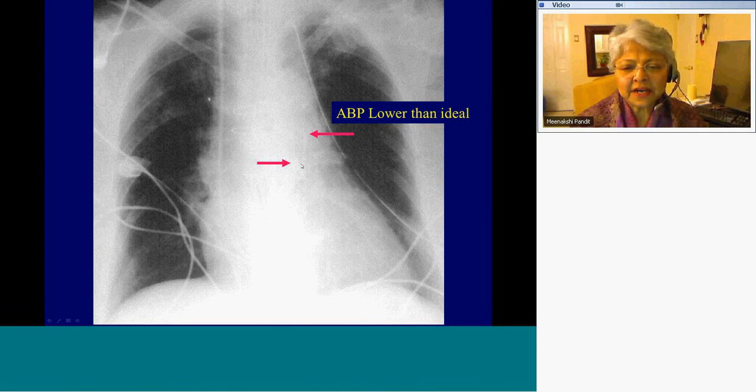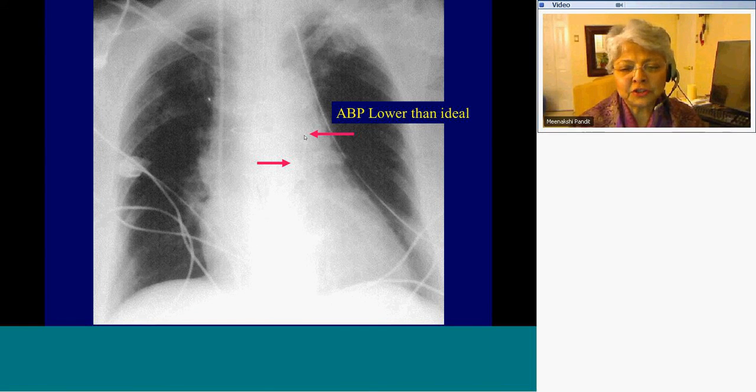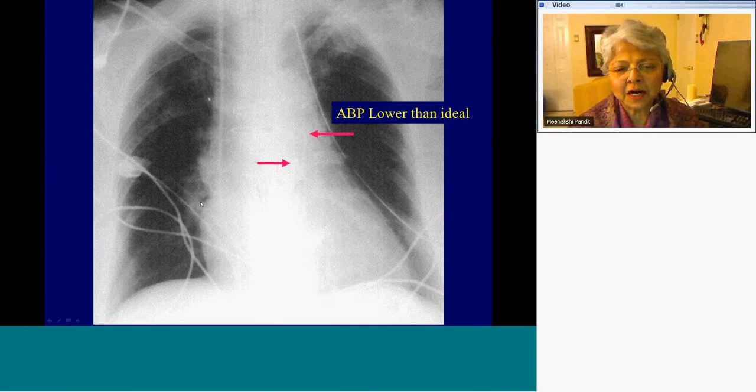This shows the pulmonary catheter and aortic balloon pump tip — this position is a little bit too low and should be a little bit higher to be ideal.